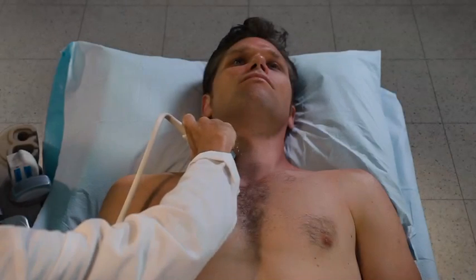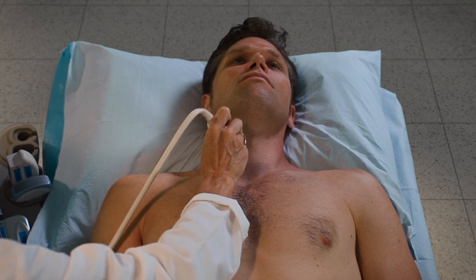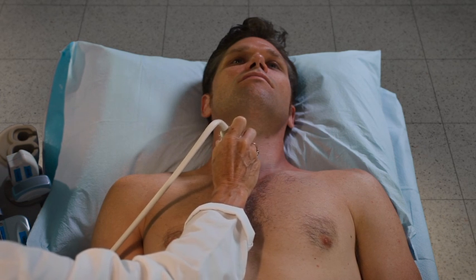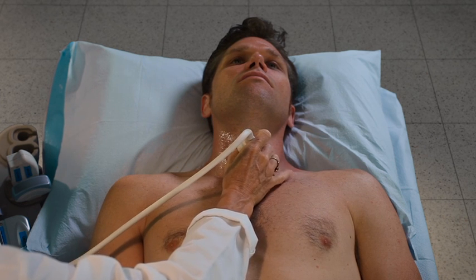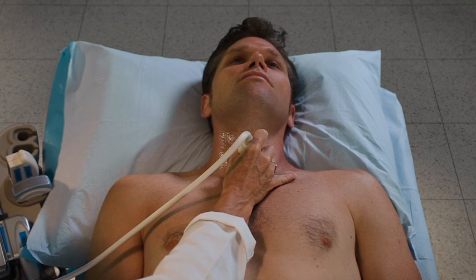Select the thyroid preset on the ultrasound device. To obtain a transverse view of the thyroid, make sure that the probe marker is facing toward the patient's right.